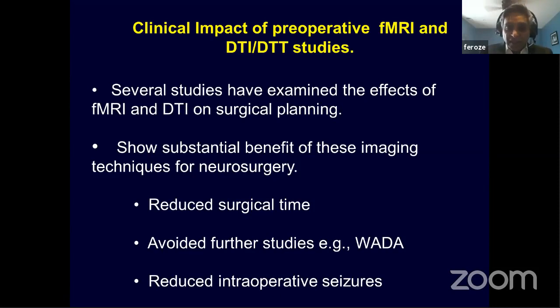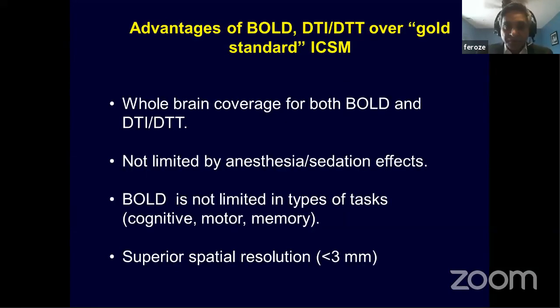And then, of course, is the intraoperative seizures. If they're claiming it's going to be reducing, and of course, you don't need to do additional tests like WADA, for example, in terms of language. So there is clear benefit in our clinics. We do almost 3 to 4 fMRIs and DTIs every week for pre-surgical assessment, and it is increasing even further.